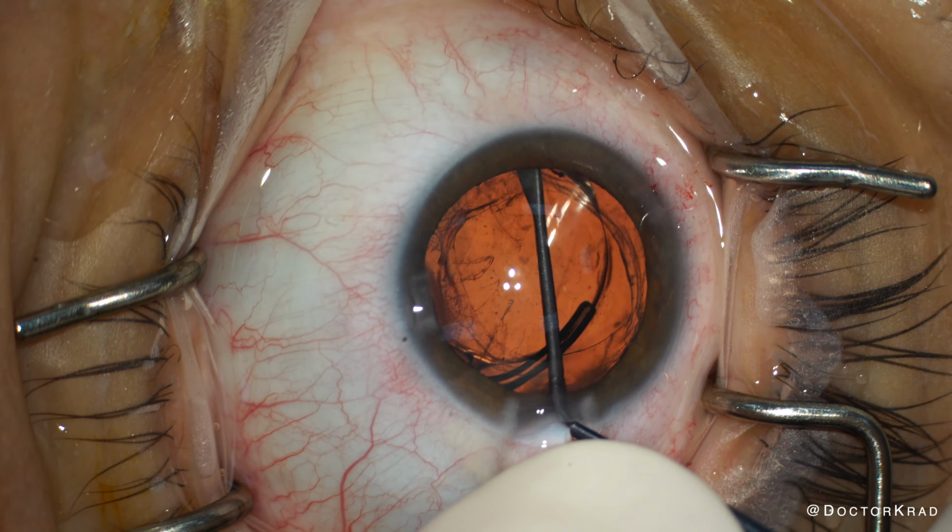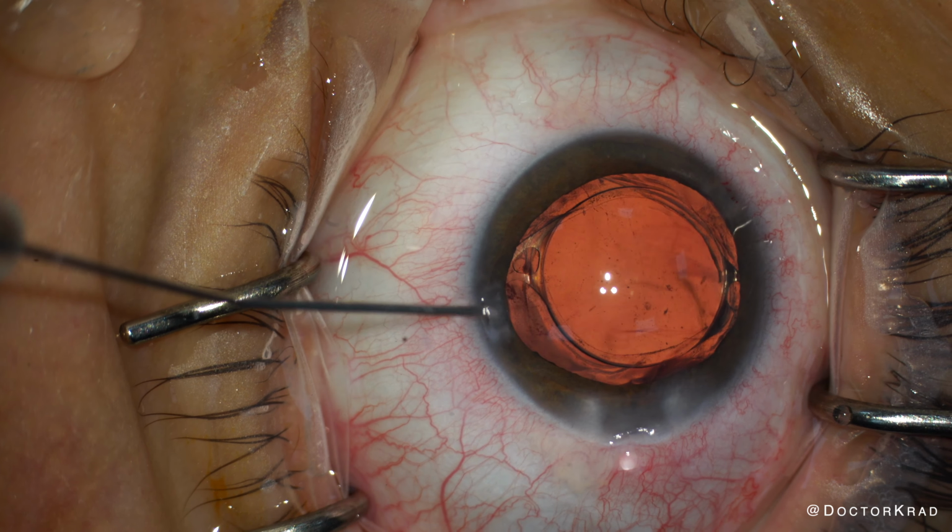And then it's really bothering me that I don't see this CTR. So here I am yet again, checking as far as possible, and it's not visible. I remove all the viscoelastic, and I take my time doing this because I was using dispersive viscoelastic, and so it doesn't come out very easily. So I just take my time. To keep the AC formed, I irrigate with BSS prior to removing my IA probe.